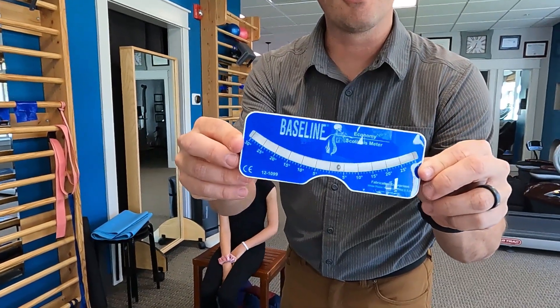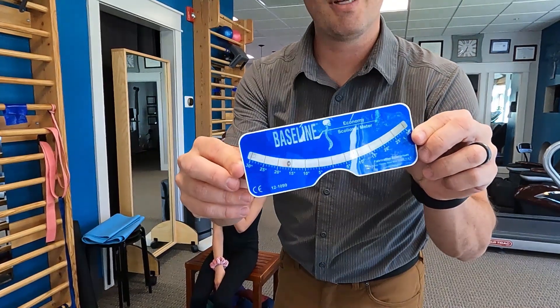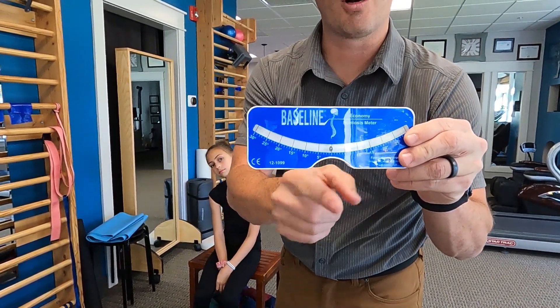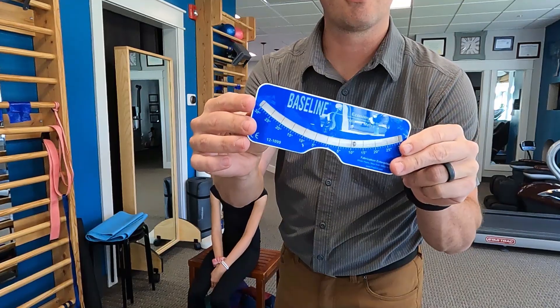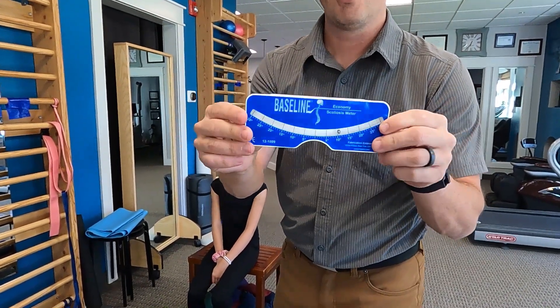So a little close-up view here of the scoliometer. This is a Baseline scoliometer. It has a little ball in there that rotates back and forth as we tip it, and then it has a little notch here for the spinous process to go right there. Whatever degree it goes to when we put it on the back, that's the number we go for — the maximum angle.